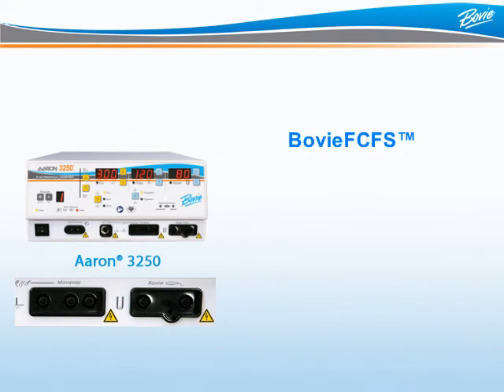Sometimes a doctor will have multiple accessories attached to a unit. The Bovee FCFS, or First Come First Serve, feature eliminates the risk of unintended activation by allowing only one accessory to be activated at any given time. Secondary commands will not override the first.